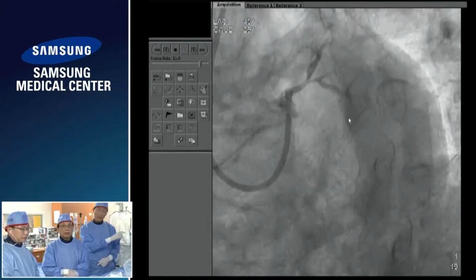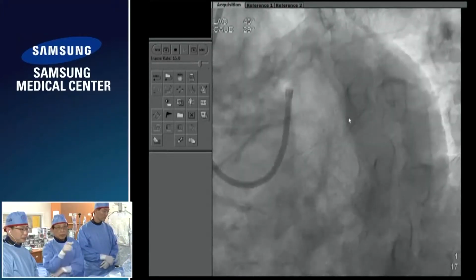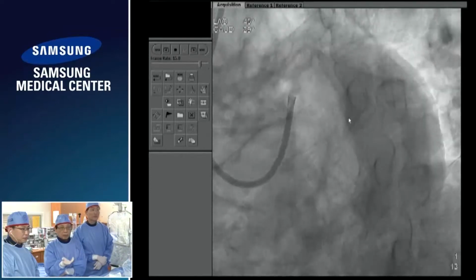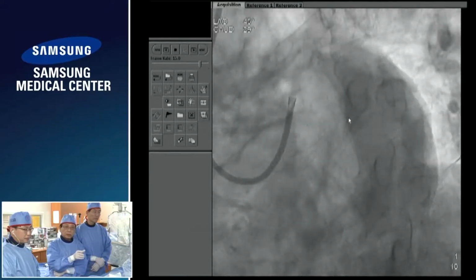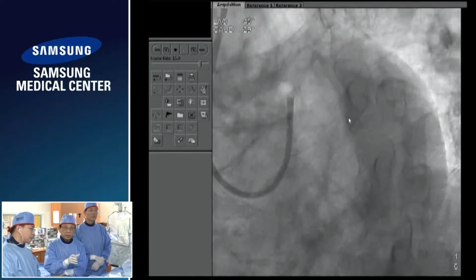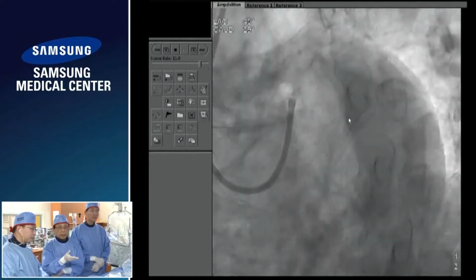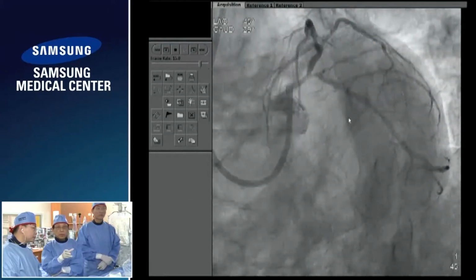As you may have seen the angio and the IVUS findings, this is a true bifurcation stenosis Medina 111, where the LAD diameter is at least 4.0 and the left main is very big, normal, and 5 or more. And this disease process extends up to the ostium of the left main. So definitely we cannot use the BVS for left main because of size limitations. For BVS, the maximum size that we can use is 4.2. So this is too big. And for these patients, Dr. Gwon has decided to use, right from the beginning, two-stent approach.